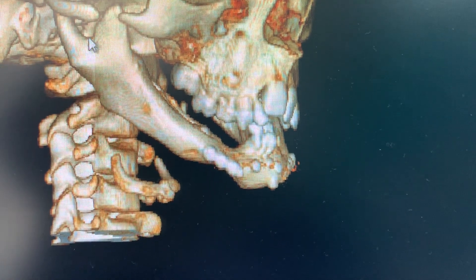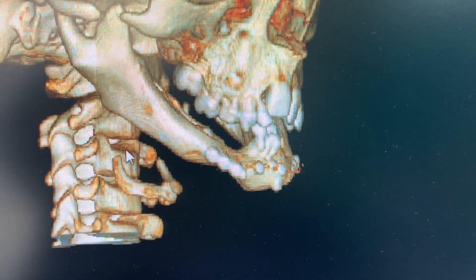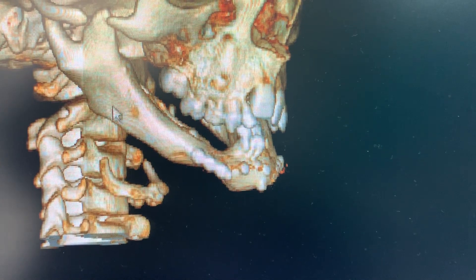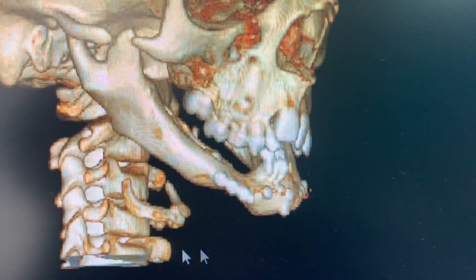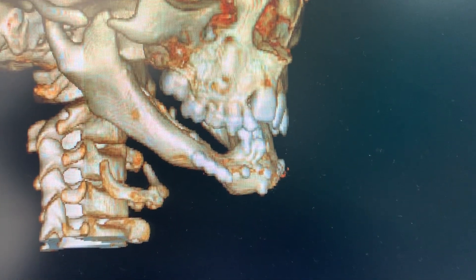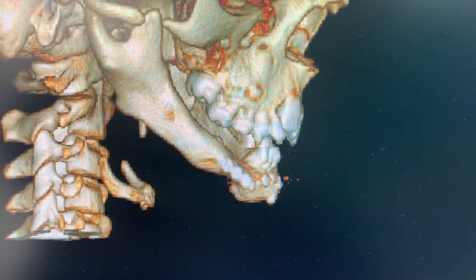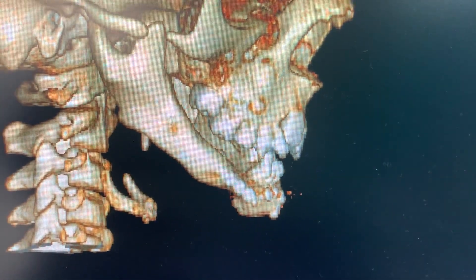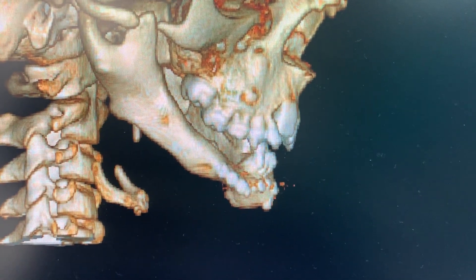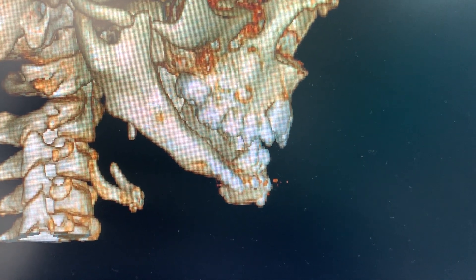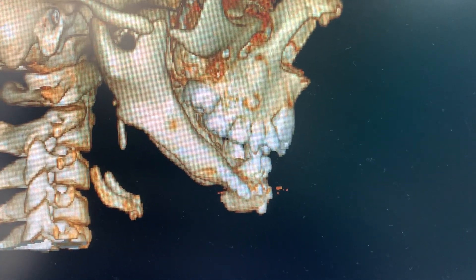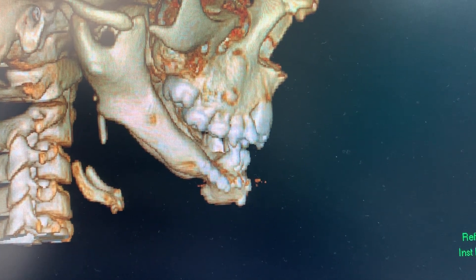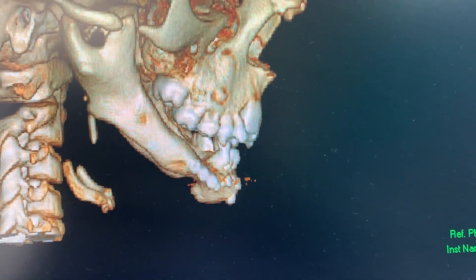The mandible goes down, so we need to get some ramal length and also achieve a bi-dimensional distraction. This is not only going to improve the patient's profile but also their function in a very significant manner. These are the other images of the patient on the left and on the right.